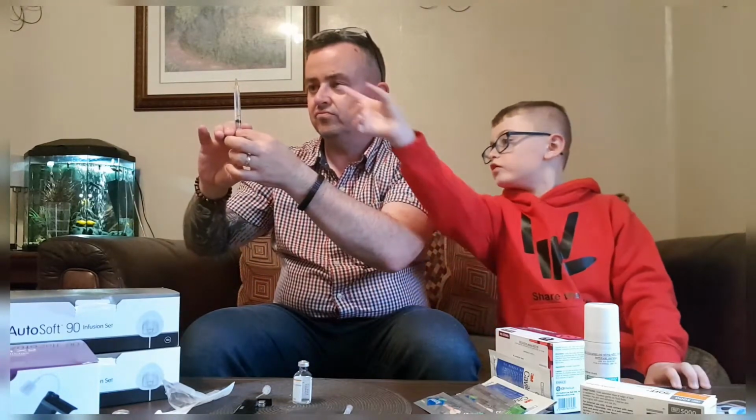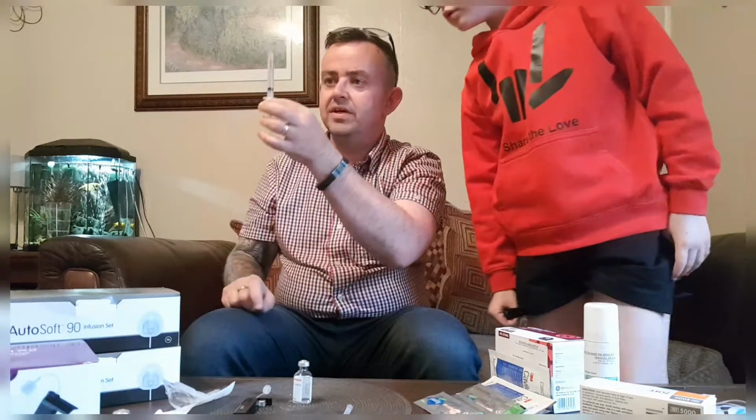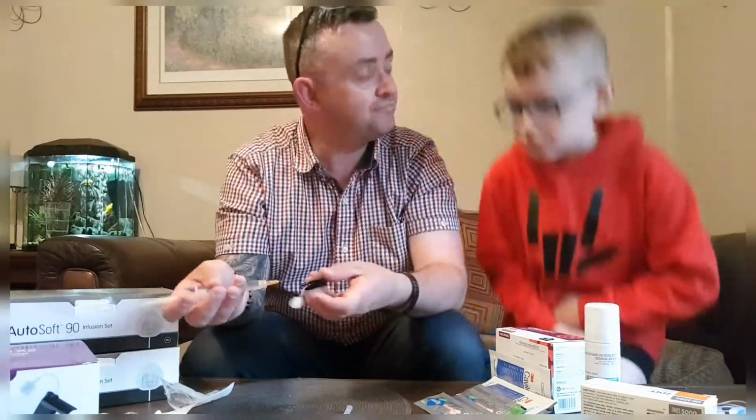Three mils, until that three? Yeah, basically full. There we go. And there's no bubbles in there. Perfect. It is a little bit harder when you're using two vials.